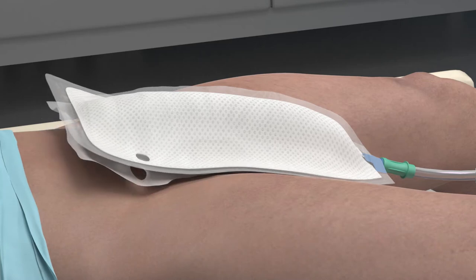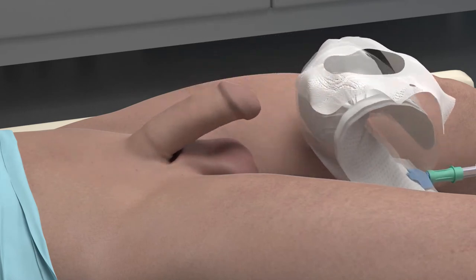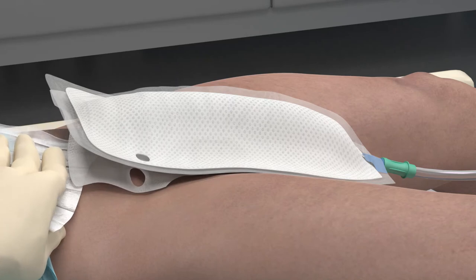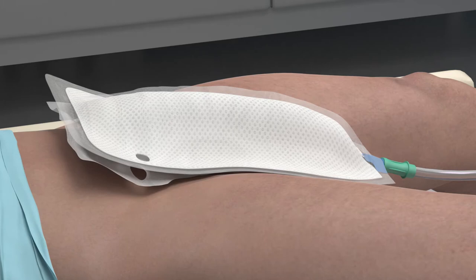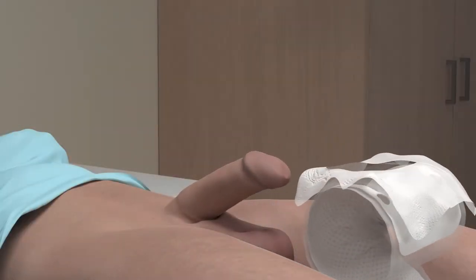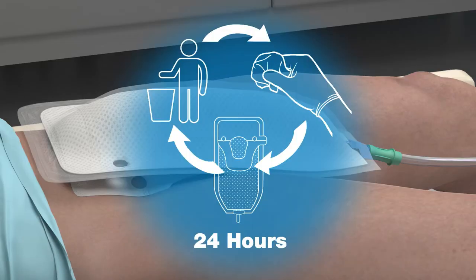Remove the device. If necessary, use a warm wet compress such as a wet washcloth to help loosen the adhesive. To avoid potential skin injury, never pull the device directly away from the patient — always peel in the direction from head to foot.